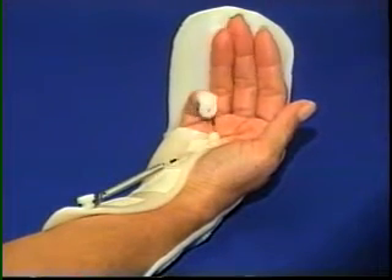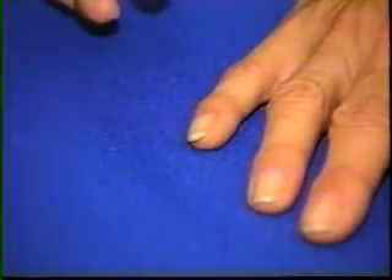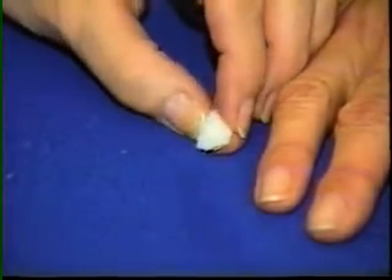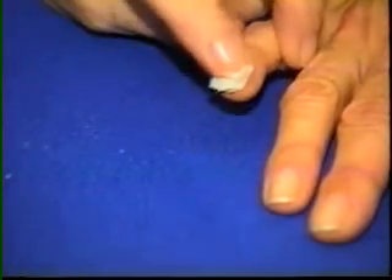This section will show the line guide fastened to an ulnar gutter splint. The fingernail is covered with loop velcro — the fuzzy side. It is important that the surface of the nail is clean. Adhesive-back velcro may be used, or plain velcro may be attached with super glue.